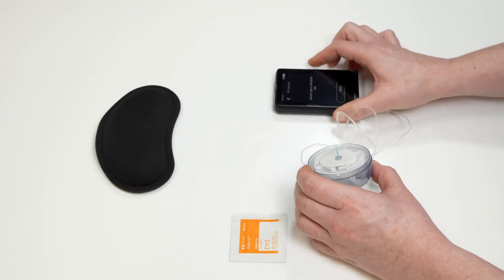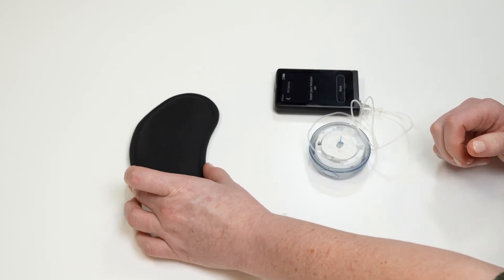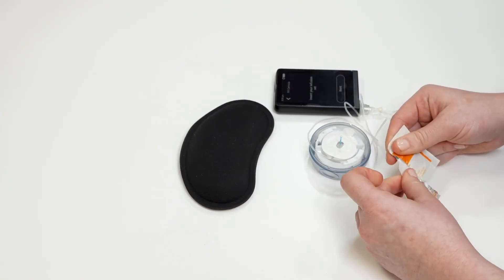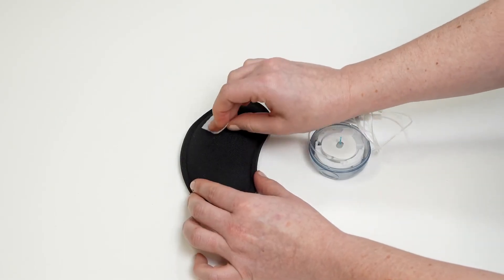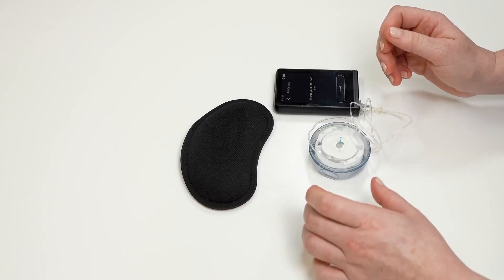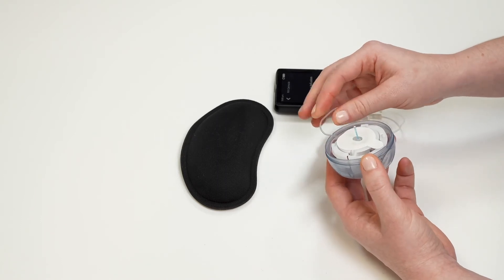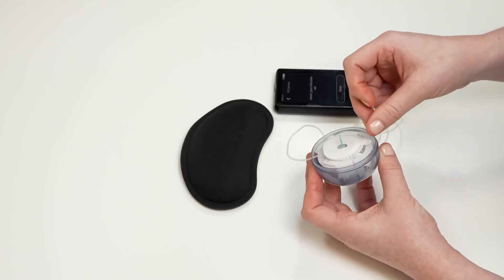Tap yes to confirm that you need to insert your infusion set. To insert your infusion set, first clean the site on your body with an alcohol swab. Carefully tuck the tubing out of the way using the small indents on the edge of the infusion set inserter. Using the pull tab, slowly peel the adhesive backing off of the infusion set. Do not pull too quickly or you will pull the infusion set off of the inserter.